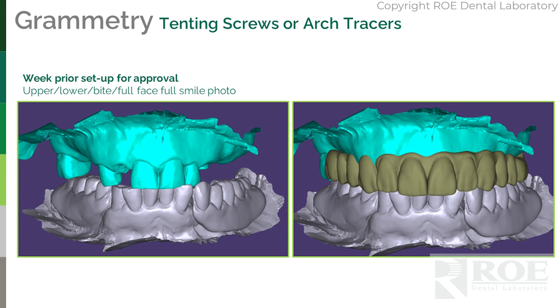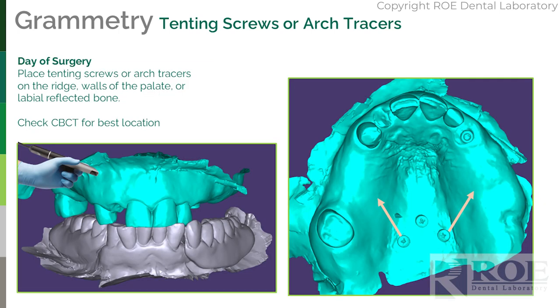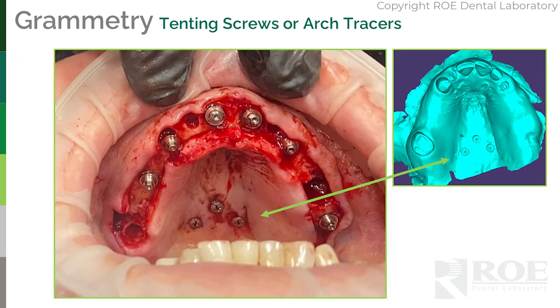We can really help set the case up for success because, you know, this patient came for aesthetics and this patient only has 5 teeth left. So let's do a setup. Let's make things ideal. Then on the day of surgery, when the patient comes in, scan. Okay, and you're going to scan with the screws, upper, lower, bite. It's go time. Go through the surgery.